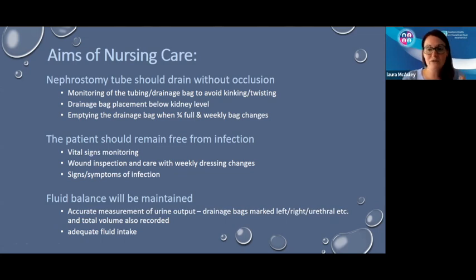They can then have bilateral nephrostomies and bags coming out there. They can then have post-operative wound drains inside and bags coming out there. So labeling is really important so that we keep an eye on what's going on and take out the right tubes at the right time. But also with any bags like this, good fluid intake is important to reduce risk of infection and maintain flow for the patient.